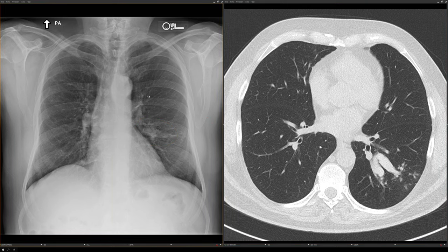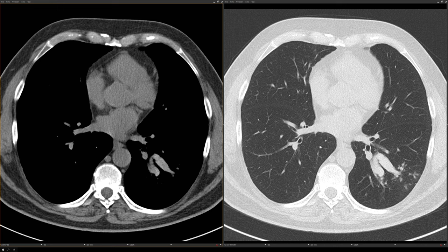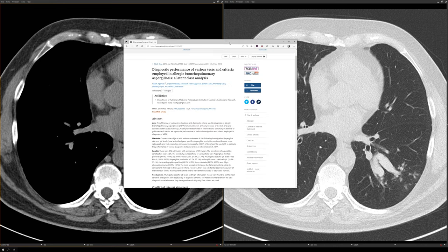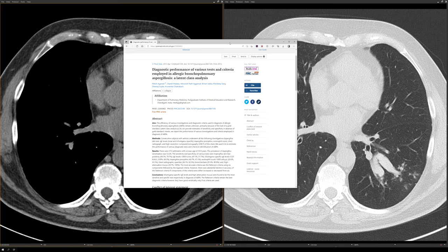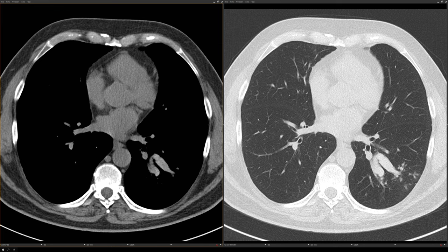The finding of high attenuation mucus plugging is very specific for ABPA. In fact, an article from 2013 describes this sign as being 100% specific. It's thought that the high attenuation mucus plugging on CT is due to calcium salts and metals, or possibly desiccated mucus. This is a really important sign in patients with cystic fibrosis, because they'll have bronchiectasis very similar to other ABPA patients — so the presence of high attenuation mucus plugging tells you the patient not only has CF, but also has ABPA on top of that. You can also see signs of small airways disease in patients with ABPA, like mosaic attenuation and tree-in-bud opacity, as we have in this patient.